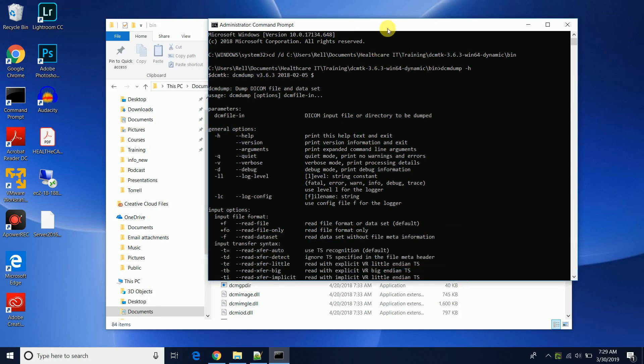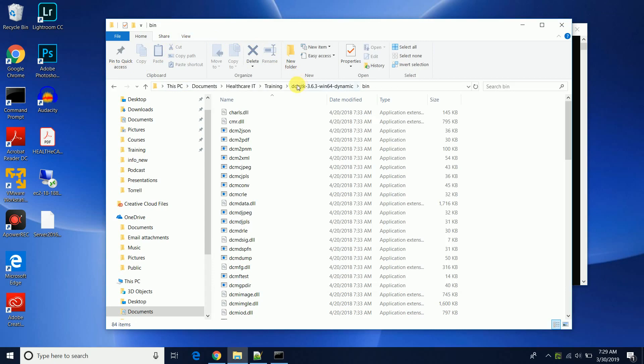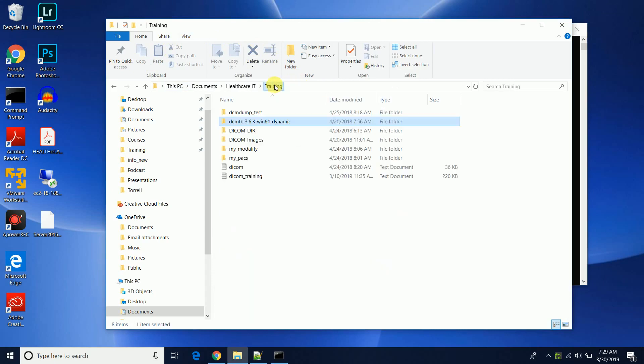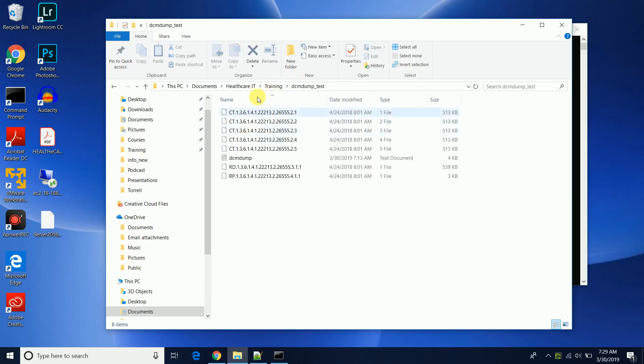Now this one here for the DICOM dump, you just have one parameter: it's the input file or the directory that's going to be used. In our example we already have our directory and content test and we have our file, so right now we're just gonna start off just doing one single DICOM file.